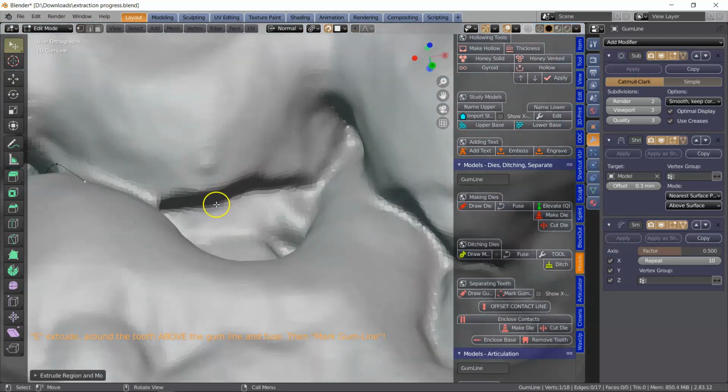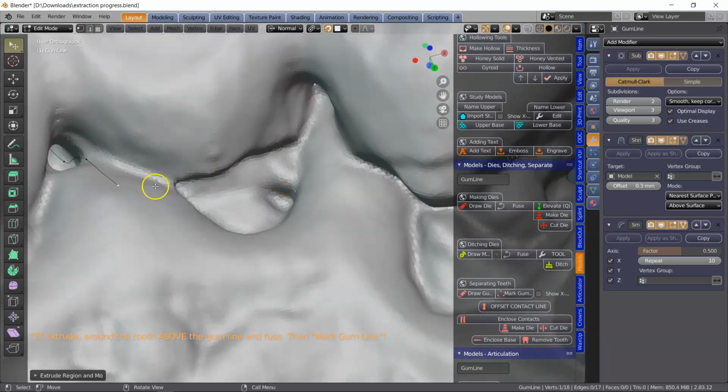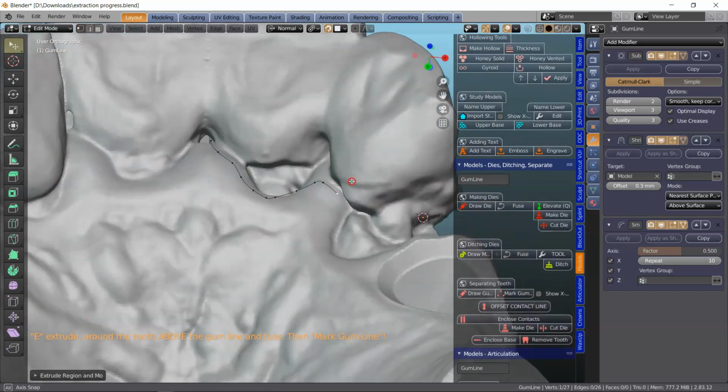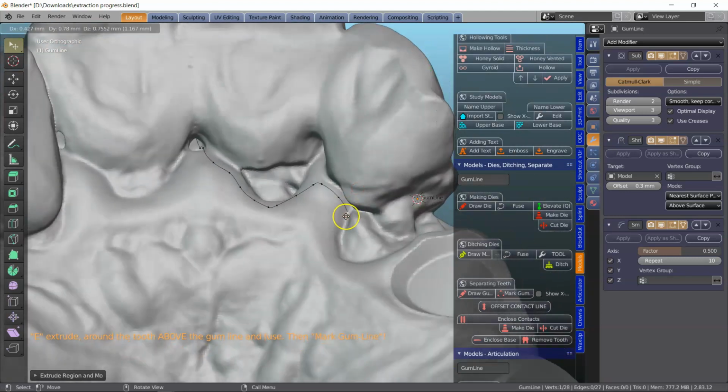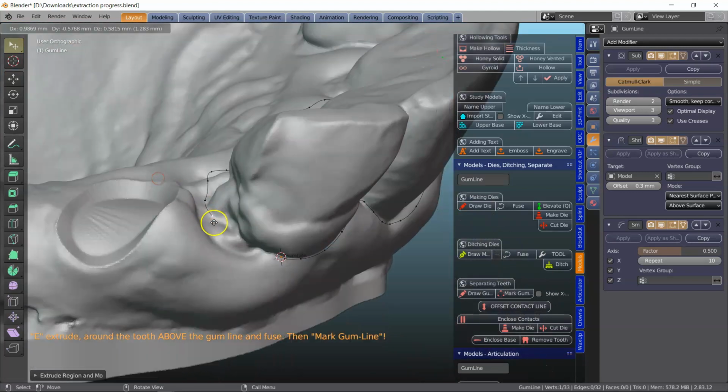If you do have mesh like that, it may be a good idea to take the scalpel tool just to sculpt it away, because with these hills and valleys and stuff, it makes it very, very difficult to cut anything. Any mesh is hard to trim. So let's just give this a go.